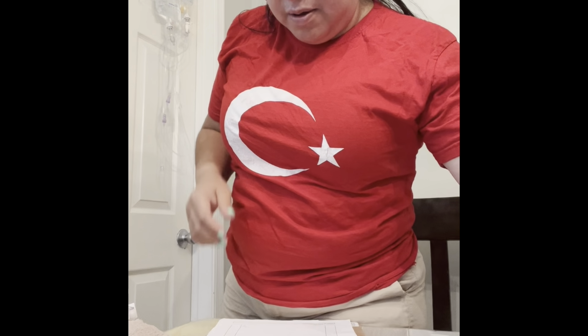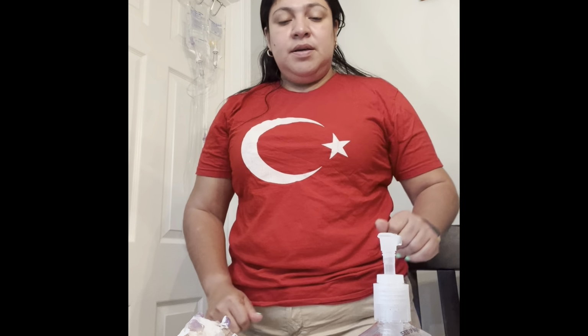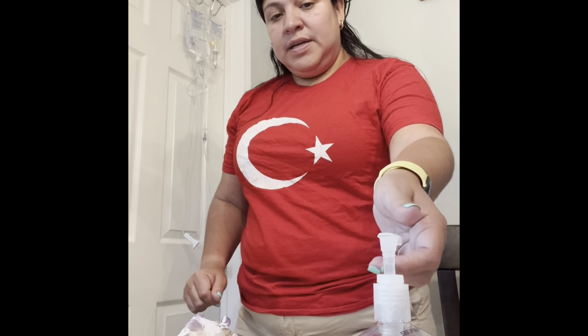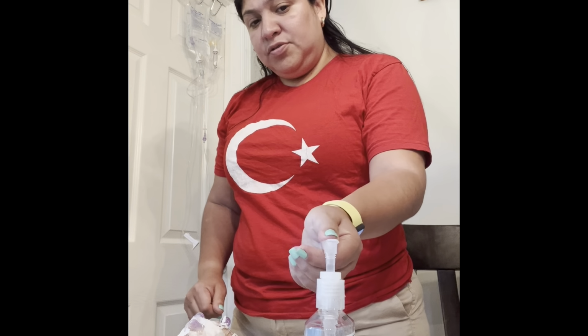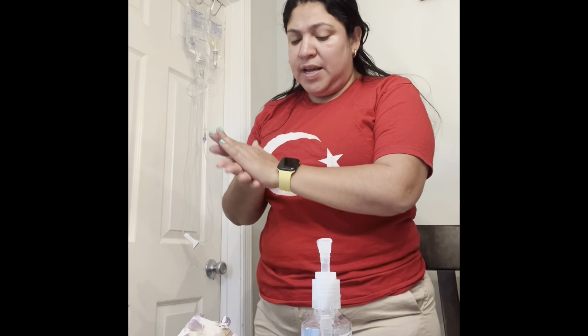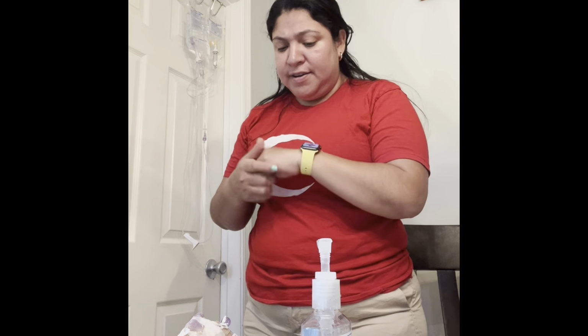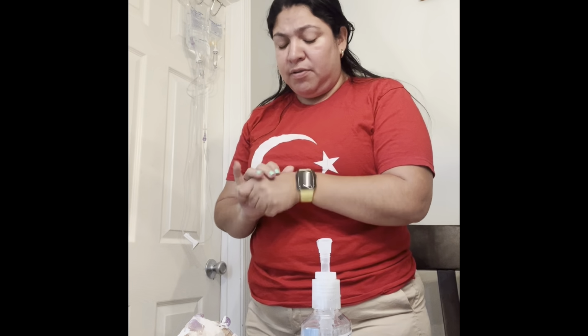I am going to now go to my patient's bed, clean my hands. So after cleaning my hands, I am going to go to my patient's bedside. I'm going to knock on the door, provide privacy, clean my hands, and introduce myself. Hi, Mr. Rene. My name is Michelle. I will be your nurse today. I'm here to give you some IV fluid hydration and some antibiotic for your urinary tract infection. Is that okay with you?